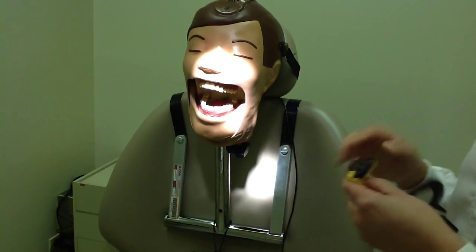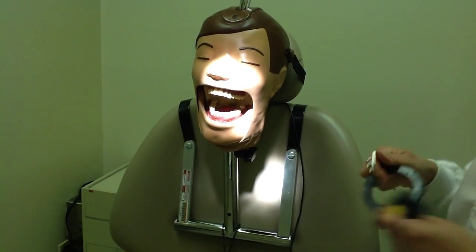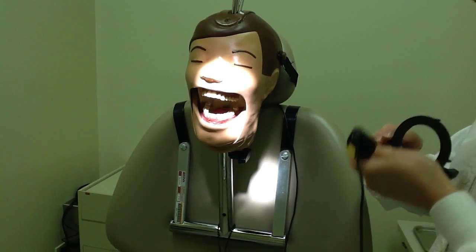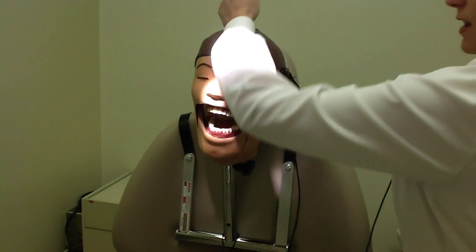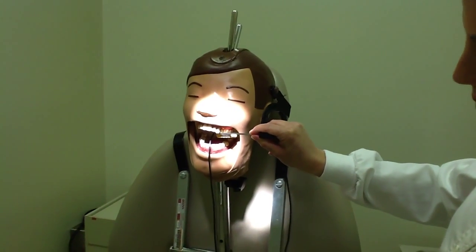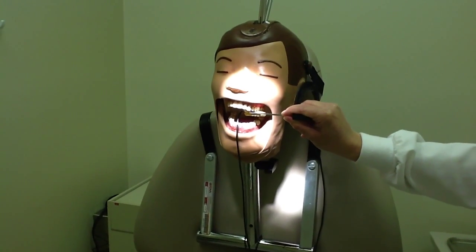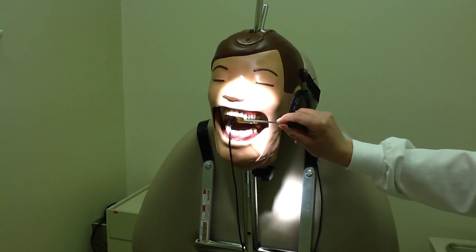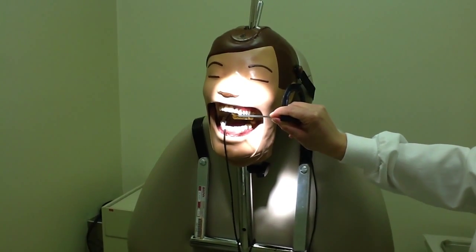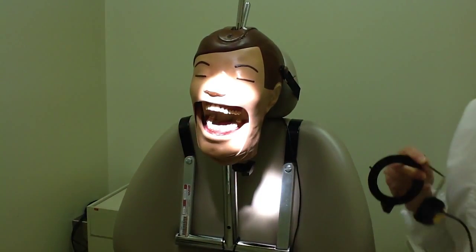But for instance, if we're taking a PA of the max, it's suggested that we go more midline. So instead of being right snug, bumped up against the lingual surface of the max, if we were taking a 2/6, we would position it more midline. All periapicals will be positioned more midline except for your mand posteriors.